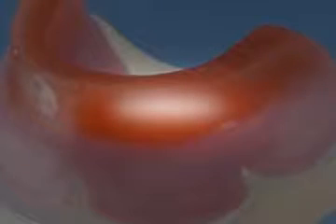Bite templates are used in order to determine the jaw position or relation in people without teeth or with severely reduced teeth. The position of the lower jaw is not constant. An example is when you wake up in the morning and your two jaws don't fit as well with each other as they did the previous day.